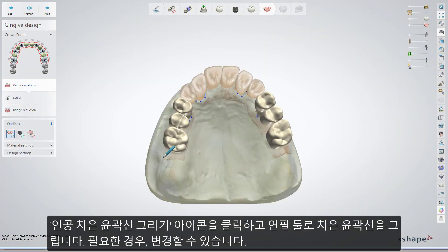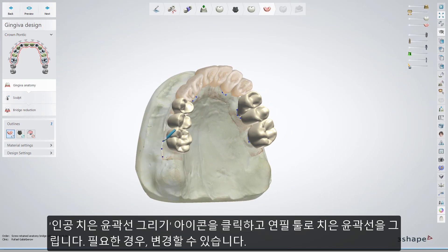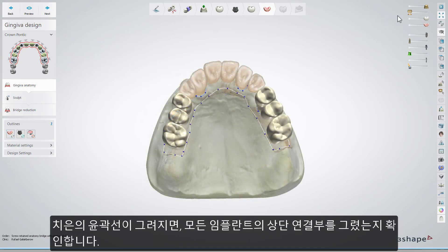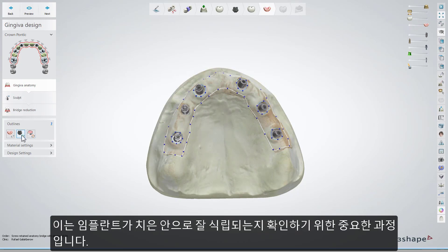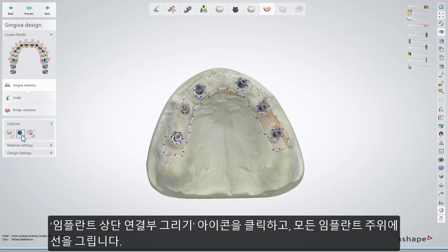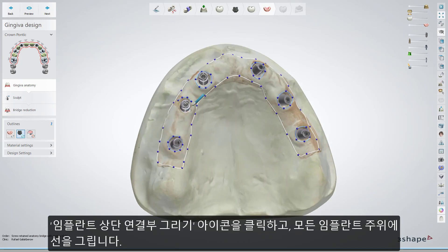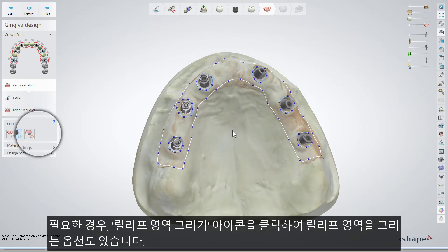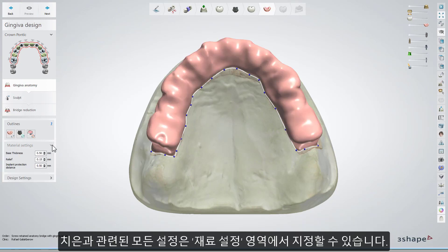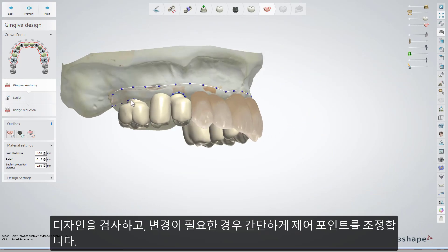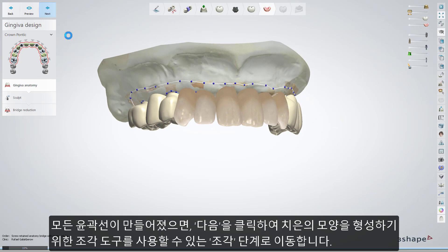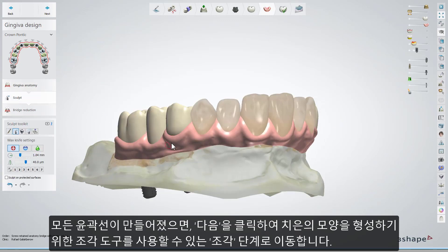Select Draw artificial gingiva outline, and then use the pencil icon to draw the gingiva outline — that can be modified if needed. When the gingiva is outlined, make sure that you draw the openings for all of the implants. It's important to do so because those openings are needed for ensuring that the implants go well inside the gingiva. Click on the Draw implant openings in artificial gingiva button, and draw the lines around all the implants. Optionally, you can draw relief zones using the Draw relief zone button if necessary. All settings related to gingiva can be set in the Material Settings drop-down menu. Check the design and edit it if you need, simply repositioning the control points. Once all outlines are created, click Next to move to the Sculpt step, where you can use the Sculpt tools to shape the gingiva.